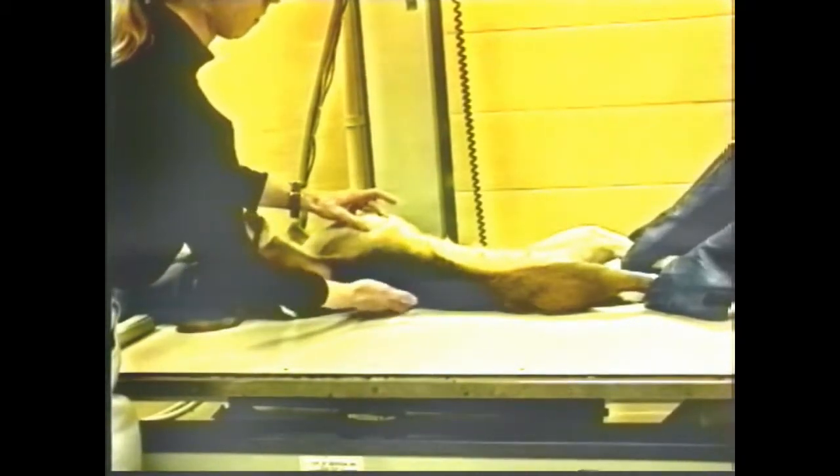For a VD radiograph, the animal is placed in dorsal recumbency. You will notice that the head is controlled between the extended front legs to help in maintaining the VD position. The rear legs are extended, placing a tension on the thorax to help in preventing rotation. The animal is measured as in the lateral view at the greatest thickness of the thorax.